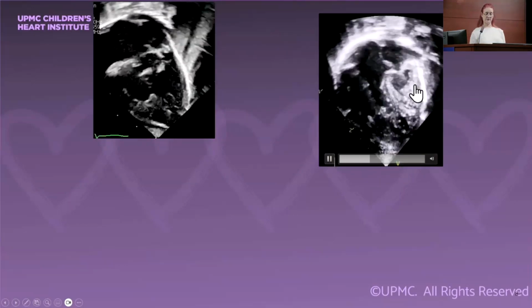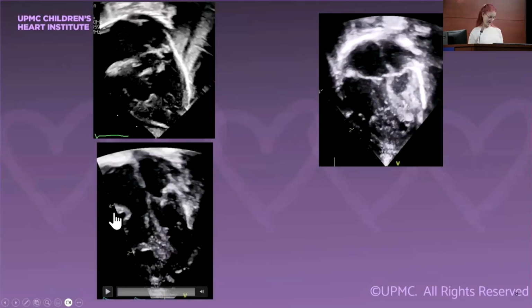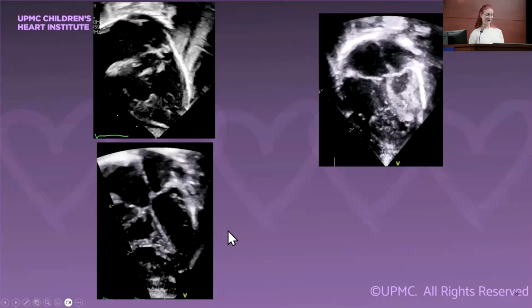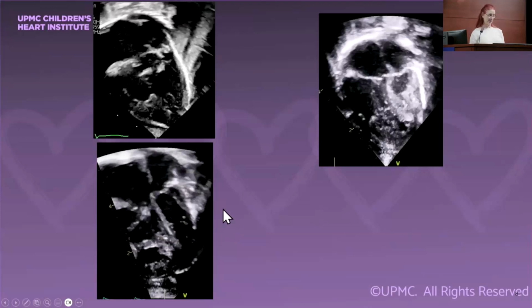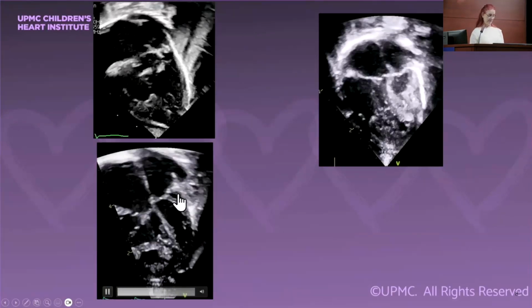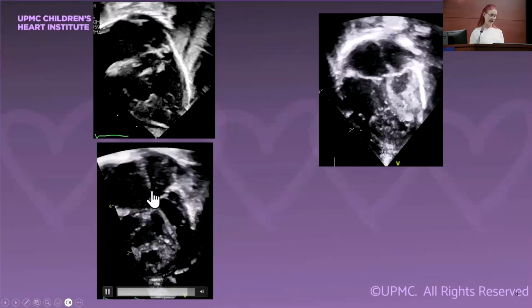This was the mitral stenosis aortic atresia that we saw. I'm going to try to use the right phrase. This was a hypoplastic left heart complex, which is mitral stenosis and aortic stenosis. And actually, it's kind of an interesting one because you can see that there is a patent mitral valve, but it's fairly abnormal. It was borderline in size.